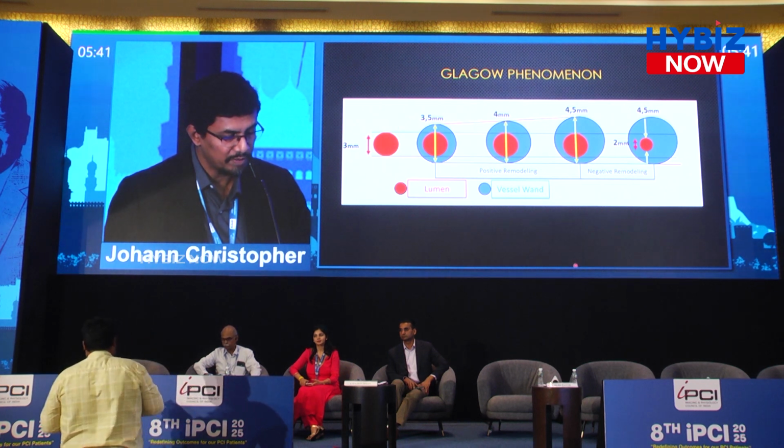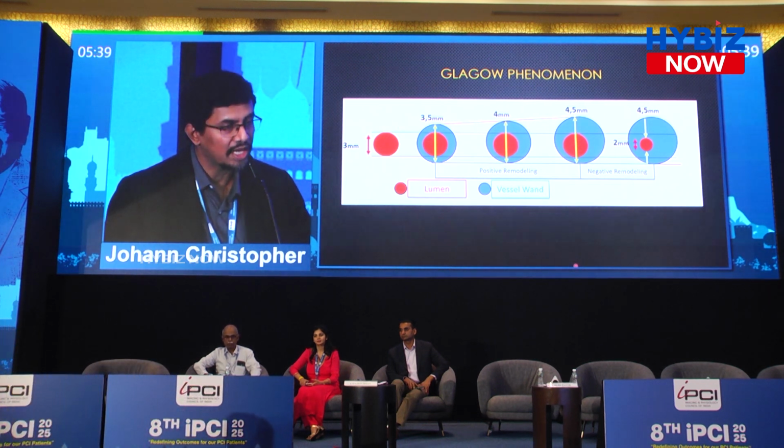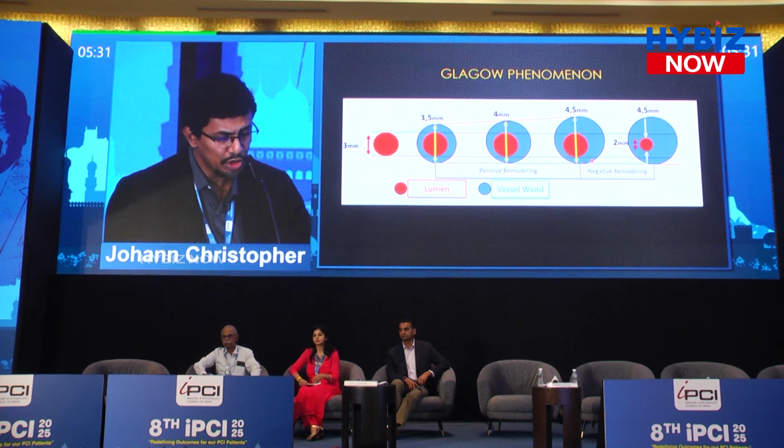We also know the pathophysiology goes by the Glagov phenomenon, and until very late, because of positive remodeling, you have a preservation of the lumen. So if you only do a luminogram, you're not going to detect the plaque till very late, and then when the negative remodeling starts happening, that's when you look at it.